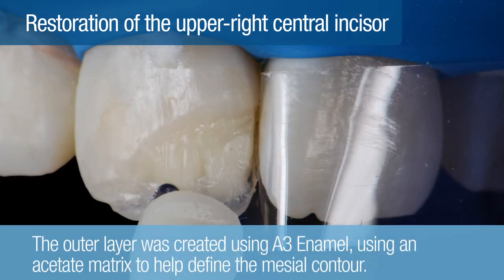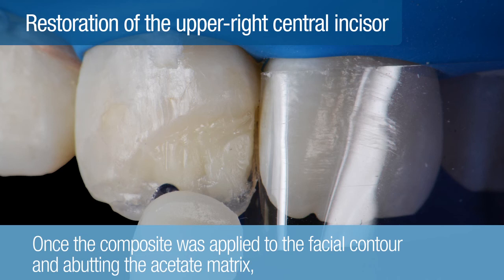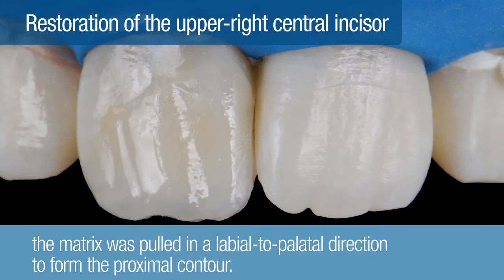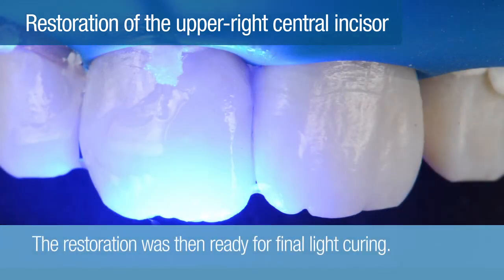Next, the outer layer was created using A3 enamel. An acetate matrix was used to help define the mesial contour. Once the composite was applied to the facial contour and abutting the acetate matrix, the matrix was pulled in a labial to palatal direction to form the proximal contour. After the proximal contour was formed, additional vestibular contouring was easily achieved with brushes. The restoration was then ready for final light curing.